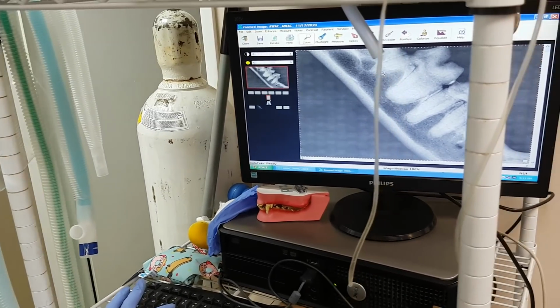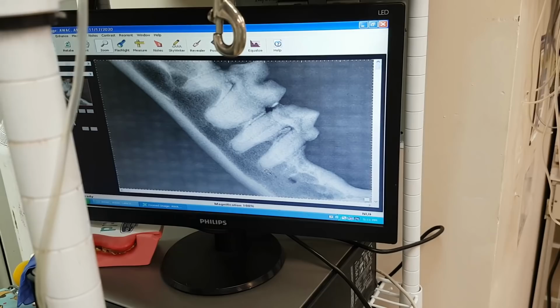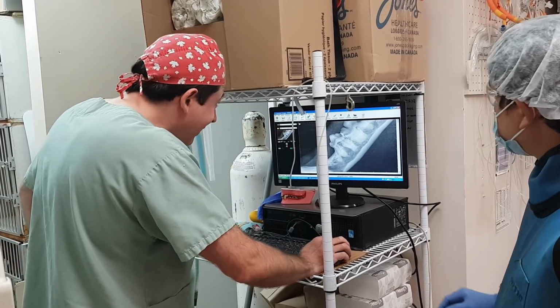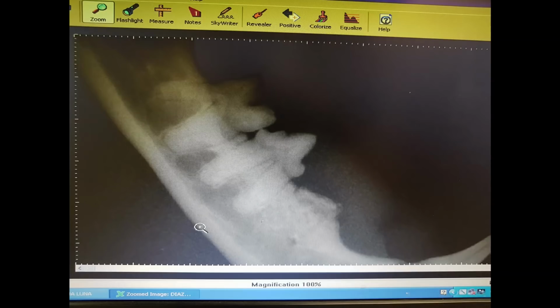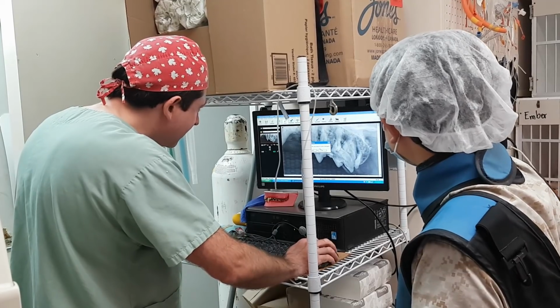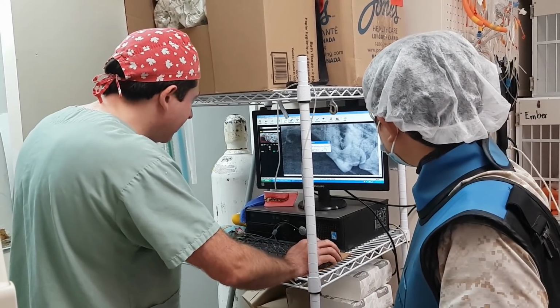Lovely jaw. I love looking at these x-rays, particularly as they're very healthy. And there NJ and I are going over the radiographs, and he's telling me what he saw in the mouth while he was cleaning it so that I can use that information to interpret the rads. Here's an example of a diseased tooth with a crown fractured and infected roots. I think it's important to say here, though, when we talk about extractions in veterinary patients, it would often be considered oral surgery in humans. So there's gum flaps, bone removal, and suturing involved. Although we do sometimes do simple extractions, we often end up doing something that's quite a bit more complicated than when a human needs a tooth pulled.